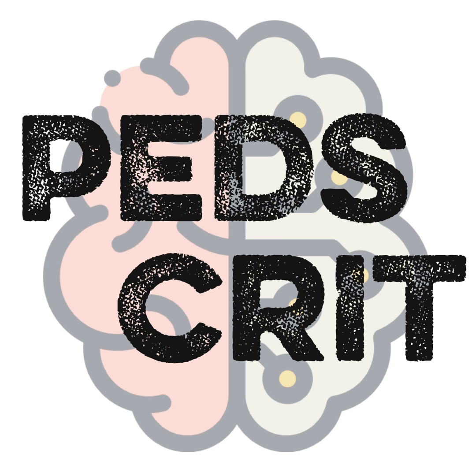In this type of patient, to be honest, it's not easy. Sometimes they have crises and they block themselves, thoracic blockade, and they just crash. So if you are on NAVA, you have to be very reactive and sedate them, paralyze them, and switch to conventional ventilation. So usually for a few days, it's not that easy. I would say that it's a difficult situation. But it may be helpful for maintaining the participation of the diaphragm, and for oxygenation at lower levels of pressure, you may usually see a benefit.